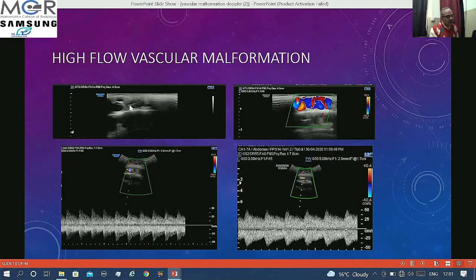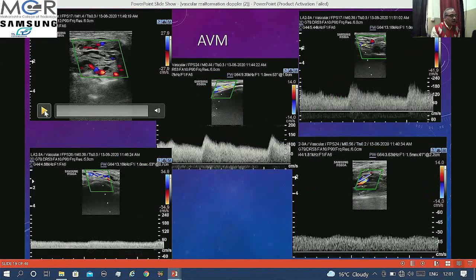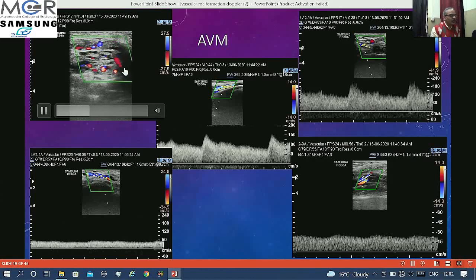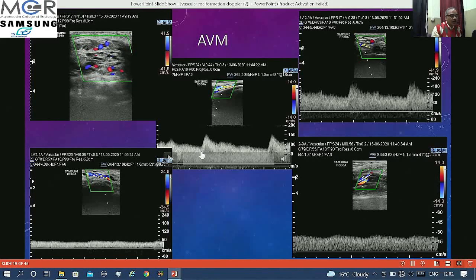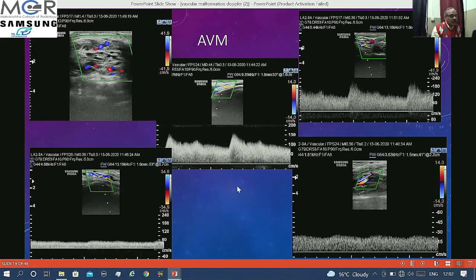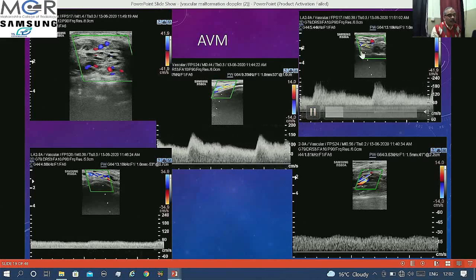Another lesion on the scalp behind the pinna: the lesion shows multiple anechoic tubular structures all filled with color on color Doppler, with significantly increased arterial flow. A peripheral lesion shows multiple channels with varying flow; with increased PRF, aliasing is still seen at multiple places — these are the areas to target for locating the AV communication. The feeding artery shows significantly increased systolic and diastolic flow, visible in real time as enormously increased.